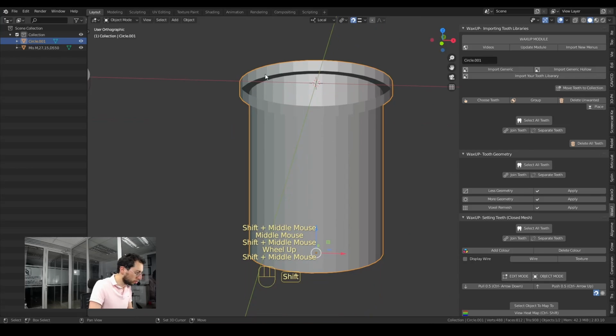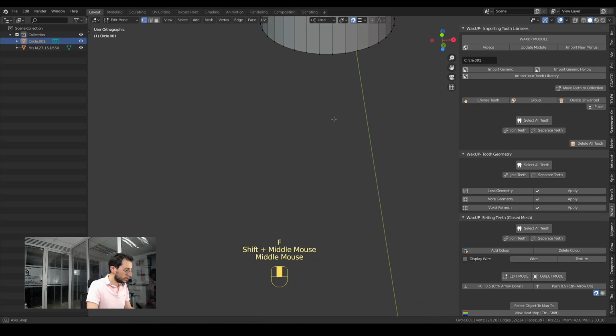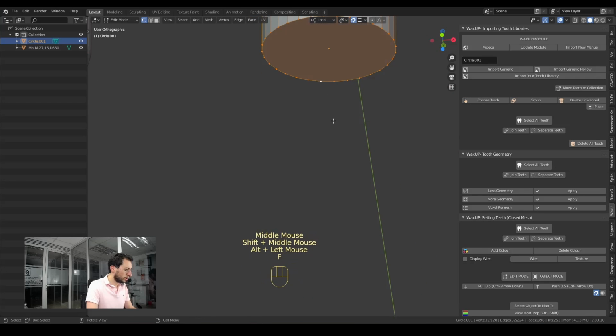And now I have to close the upper part, same as before, Alt and click. I give a click, the click is on the line, okay? Then F to close it. Same thing down here, Alt and F.